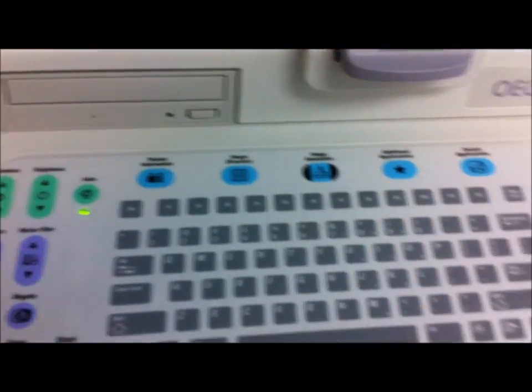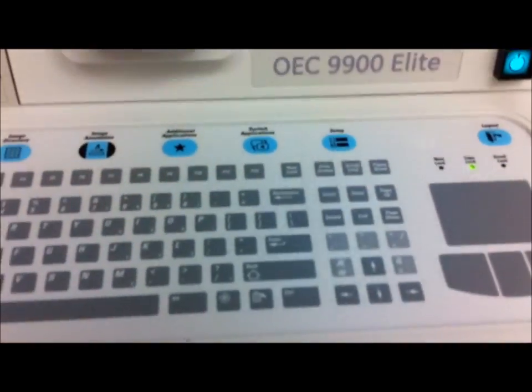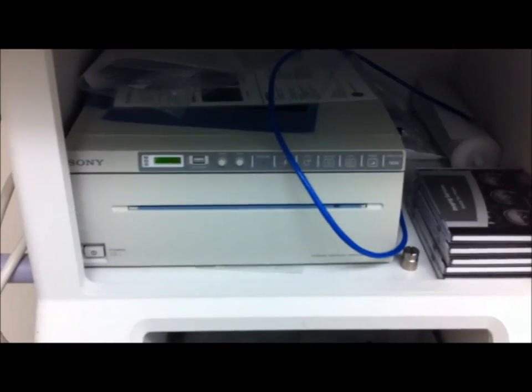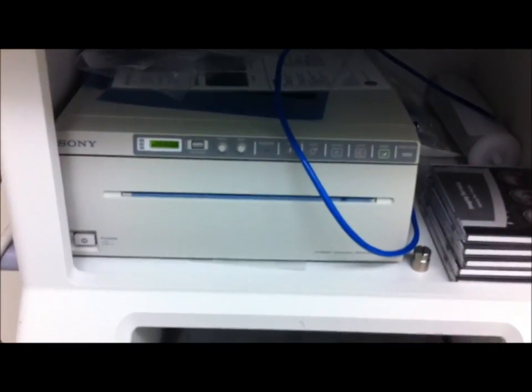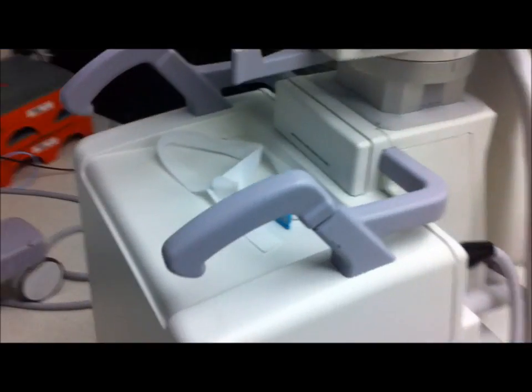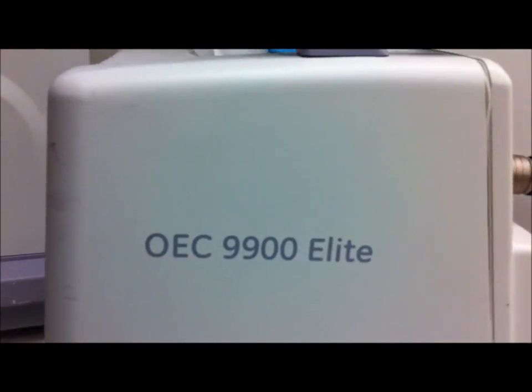And I believe that's officially it for the little tour of the OEC 9900 Elite. We installed our own film printer there. And that's it — that's the 9900 Elite.